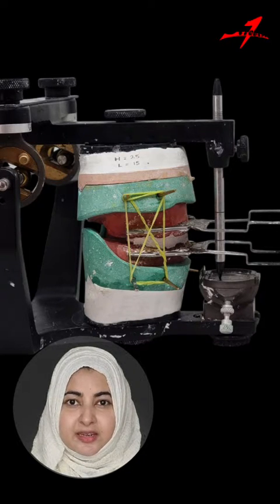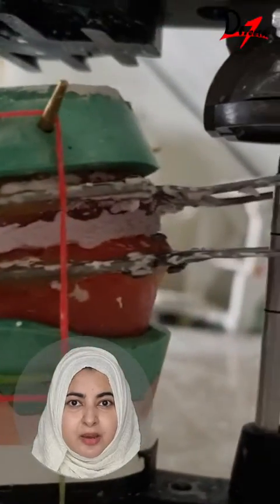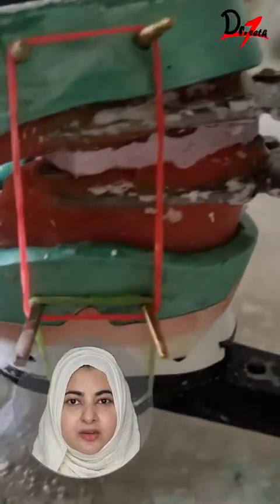If the centric is correct, there will be no space between the split and the upper cast. If there is a discrepancy, then we remount the lower cast with the record stabilized.